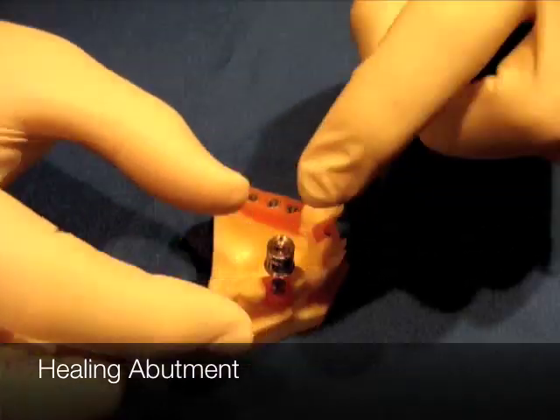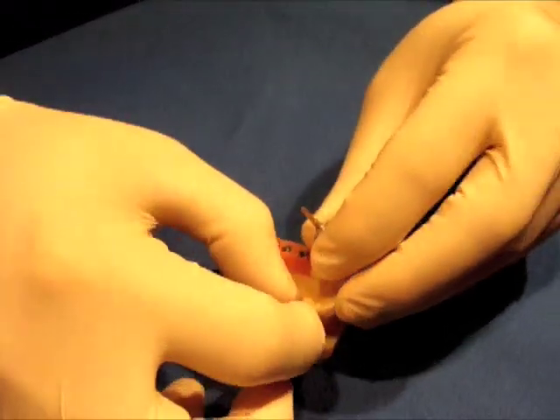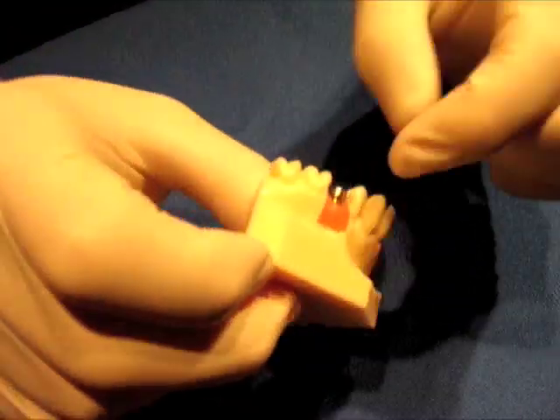So when you put the UniGrip driver down, you're going to take that little unit out of there. And when you take that out, you're able to remove it — there it comes. You give the patient a little shake like that and take it out.